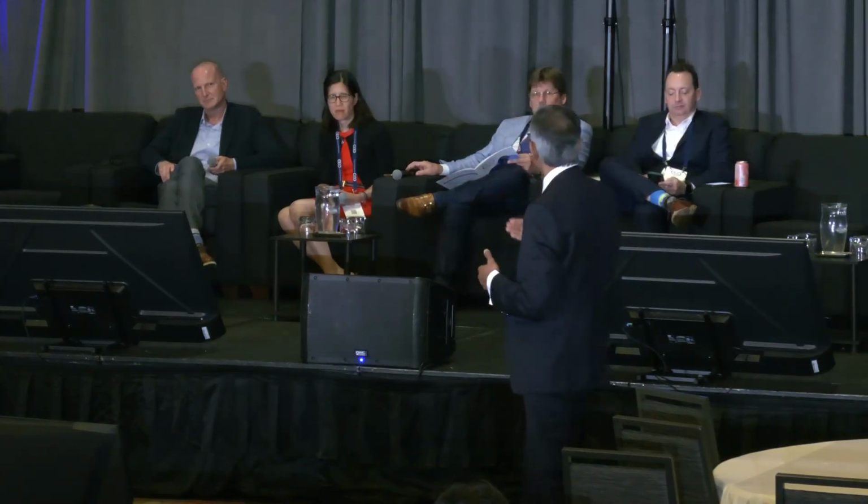But I do think that, I always tell myself that the crossing strategy determines the end strategy. That is why if you work it backwards, I can't elucidate all the facts, but it makes sense how to approach an artery and make the initial forays, because the final outcome will be dependent on the first movement you make in treating a complex long lesion.